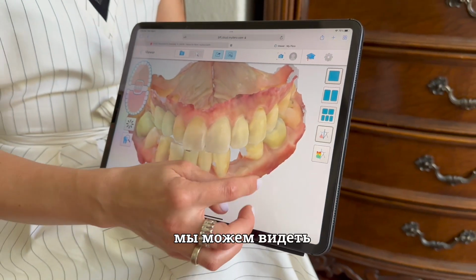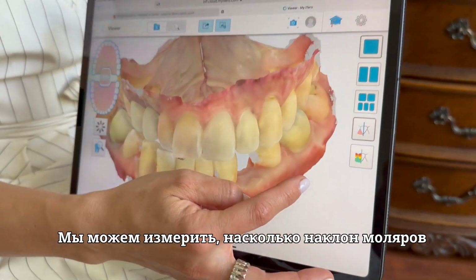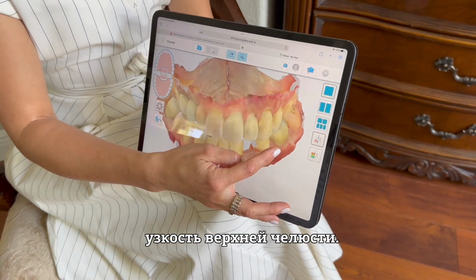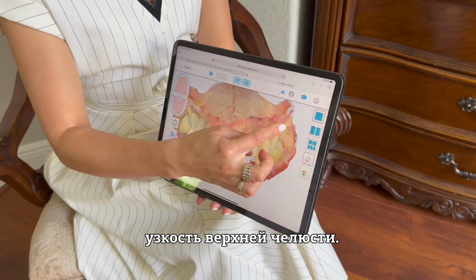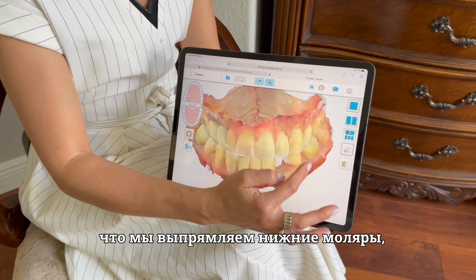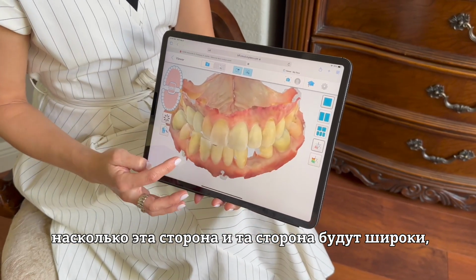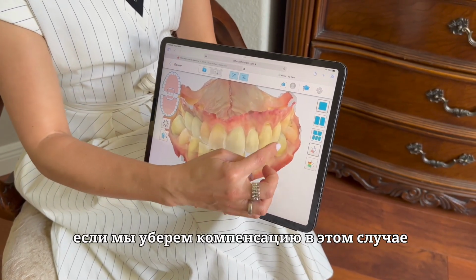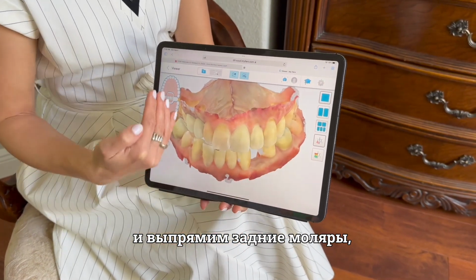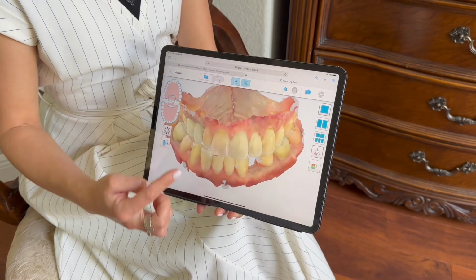And based on that, of course, measuring with the CBCT, we can measure how much of a camouflage lower molar tipping is here that compensates for the upper narrow jaw. So if we imagine that we upright lower molars, how wider this side and this side would be. If we decompensate this case, if we straighten up these back molars, how wider the lower becomes. Based on that, this is the first consideration.